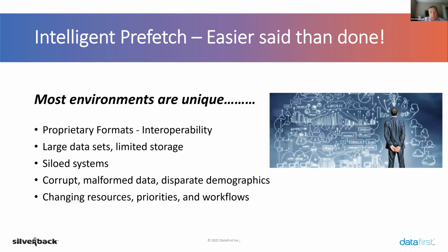All right, so anybody who's tried to do prefetch knows that it's easier said than done. Especially given some of the challenges we talked about on the last slide, and we're going to call some of those out. Proprietary formats, right? While we all know DICOM, we also know that not everybody, but many manufacturers deploy that differently, or they'll have their own proprietary storage. So moving those exams from those various proprietary storage solutions is a challenge.